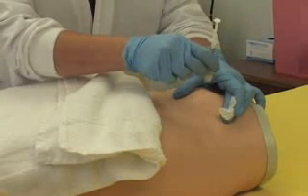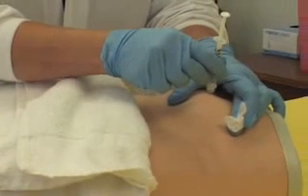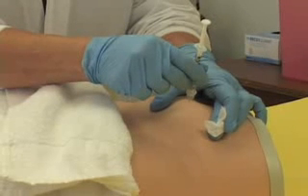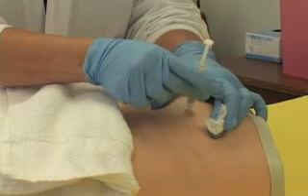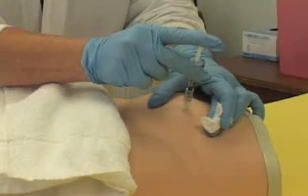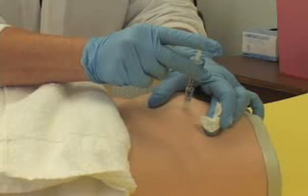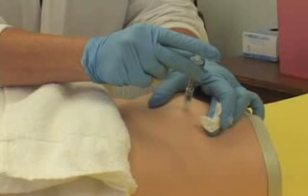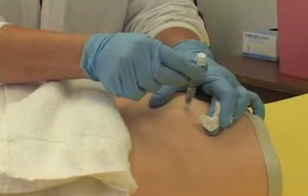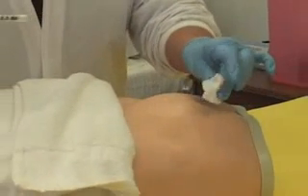Hold syringe barrel in dominant hand between the thumb and forefinger like a dart. Dart the needle quickly at a 90-degree angle. Give insulin deep sub-Q, which requires a 90-degree angle. Do not aspirate when injecting insulins or anticoagulants. Inject the medication slowly. Withdraw the needle quickly at the same angle at which it was inserted.